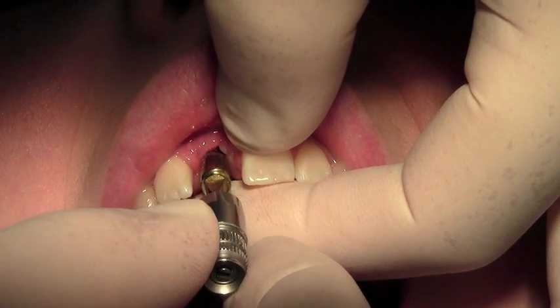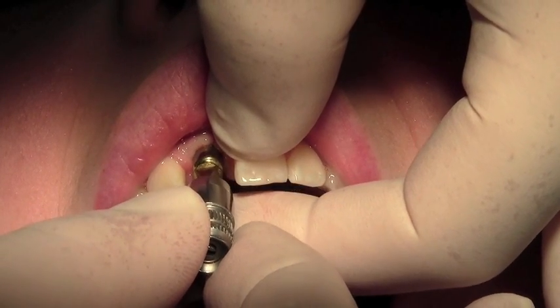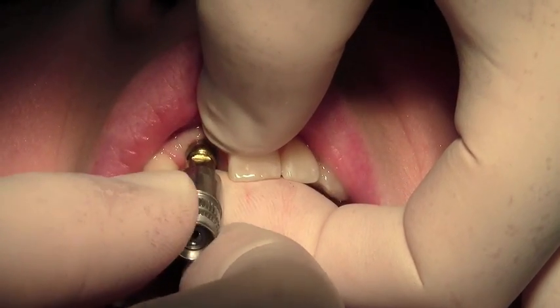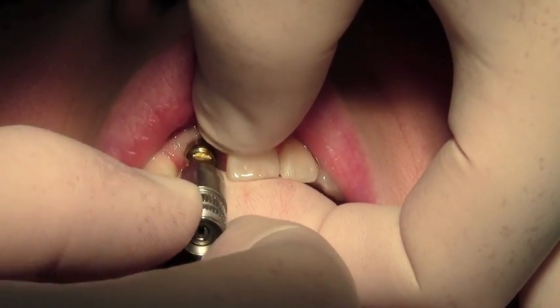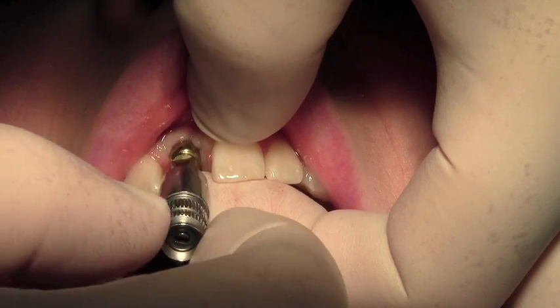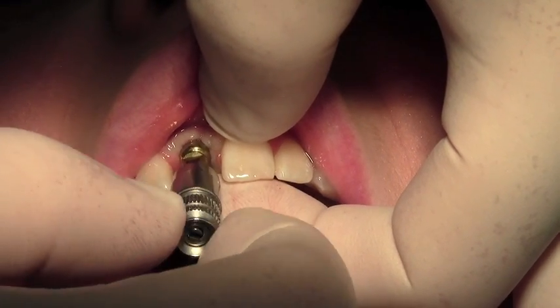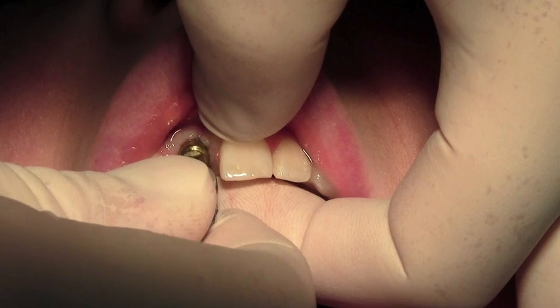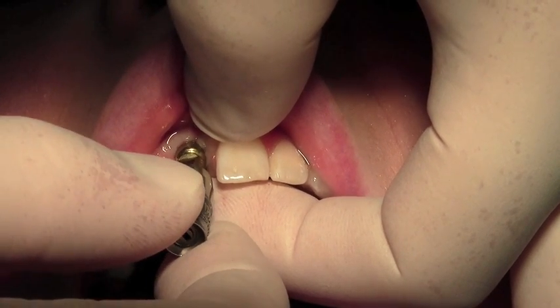The hex of the impression post should engage firmly into the implant, and as you tighten the impression post you can see that it's seating all the way down. You can feel on the driver a firm metal to metal contact.